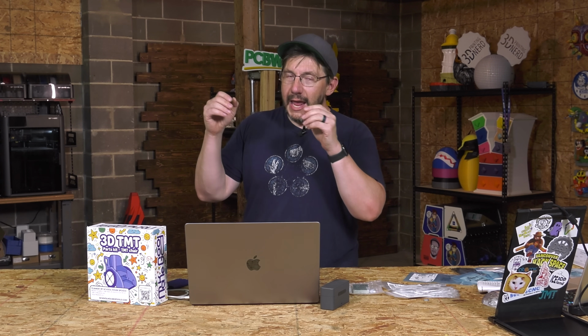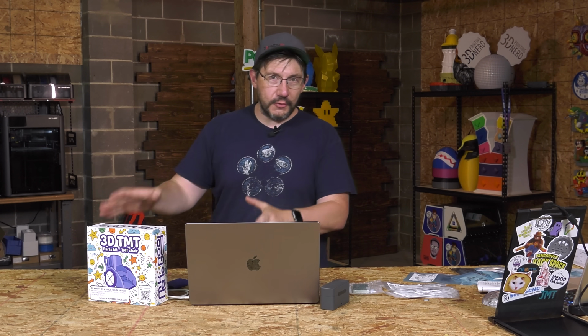So one of the things that really made me excited about showing you this is that I'm about to show you how to build a custom toddler mobility trainer. And the colors that were chosen were thematic because the kids and the parents were like, they like blues and greens or purples and pinks and yellows and whatever.